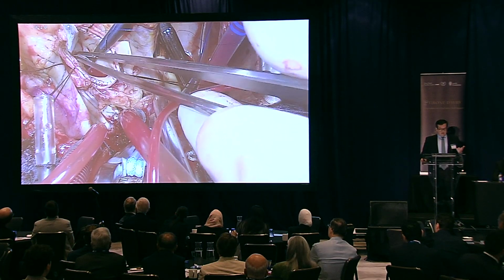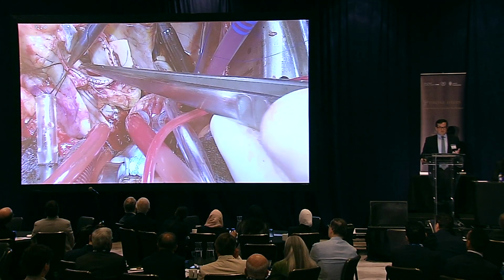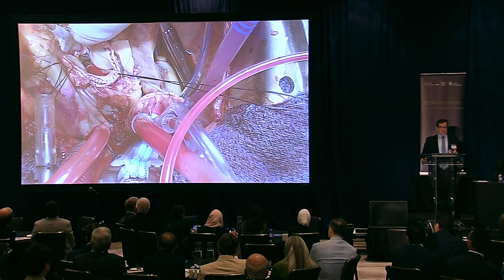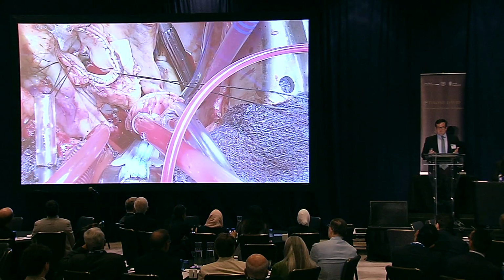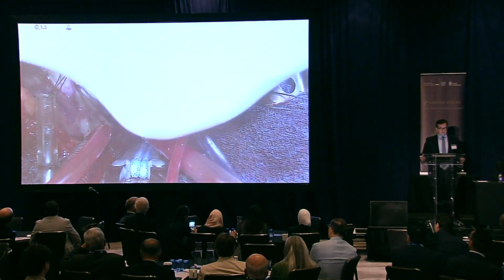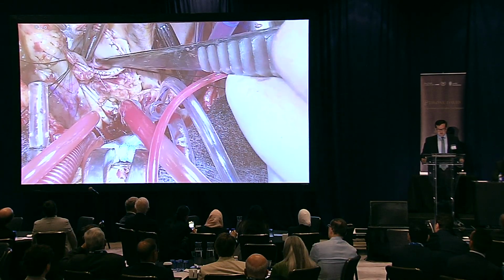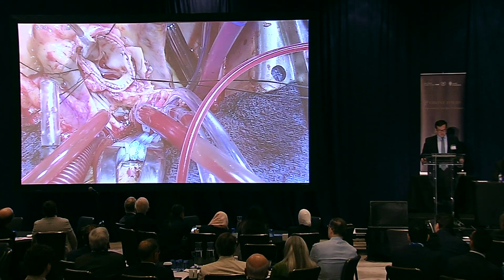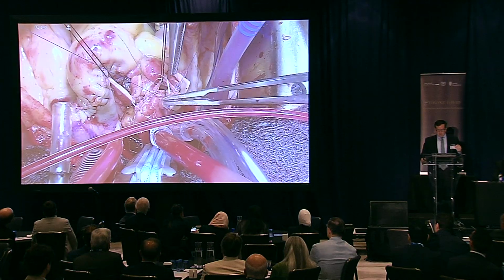There's very limited ability to make judgments about how big of a plication, because you can't really evaluate the free lengths. You can't really evaluate the effective height. And the best you can probably do at the end is try to bring them together and see if your LV vent can create some suction effect. But it's a bit of a leap of faith that you have to make in terms of doing it. When we open and then close this, you'll notice that we opened up the graft.